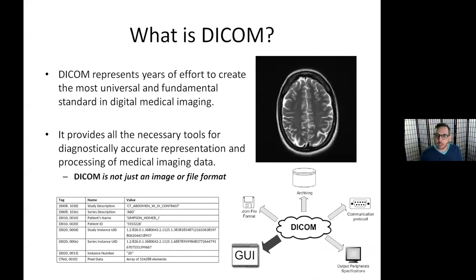Now I think we're kind of to the point where you can also answer what DICOM is. So it represents years of effort. It's a standard. It's not just an image or a file format, but it covers the archiving, the communication, the output, and also those files that create these pictures. And what's not seen here is the header, which is the metadata, which has the patient's name, the patient's diagnosis, when the study occurred, all that other information that's important in putting that image into context.